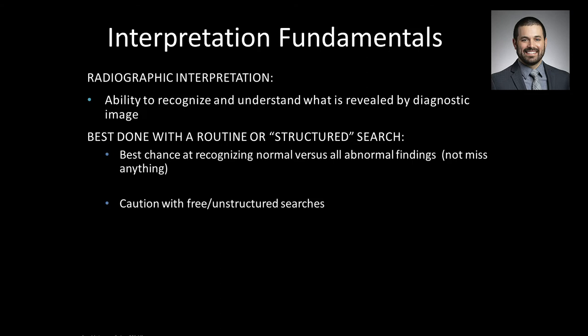The opposite, or where you can get into trouble, is with a free or unstructured search. What that looks like is if you just jump into a scan and you're concerned about, for example, implant site number 19, and you go straight to that implant site. What you have not done is disciplined yourself and looked through the entire scan volume, and you may miss some very large surprise finding. That's an unstructured search.